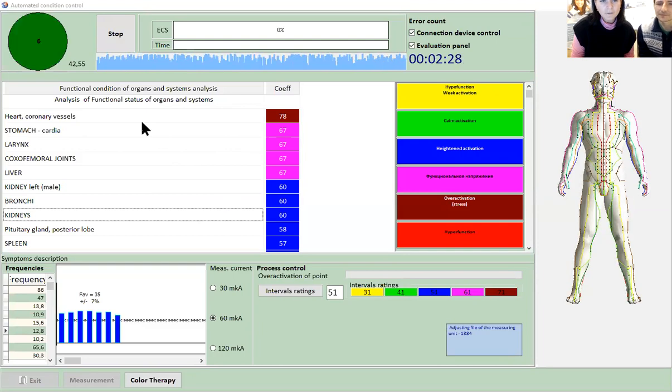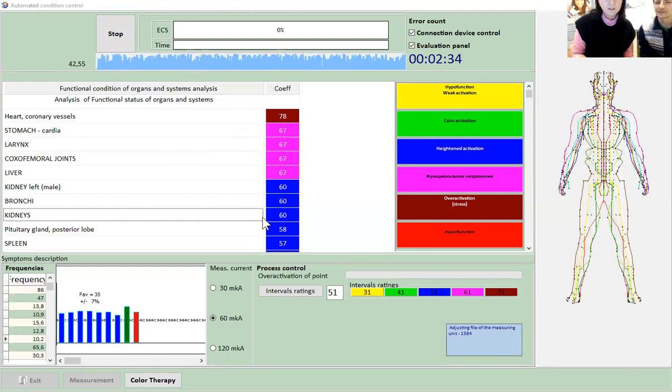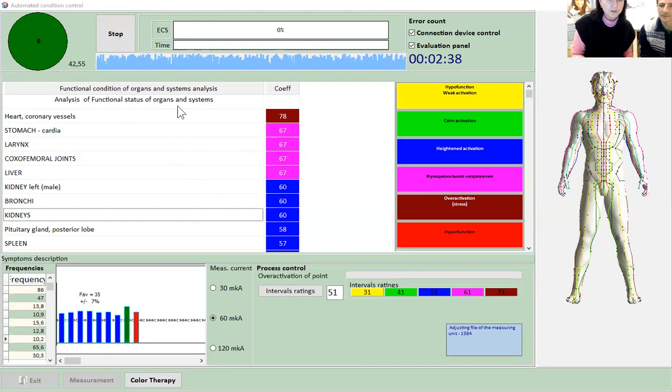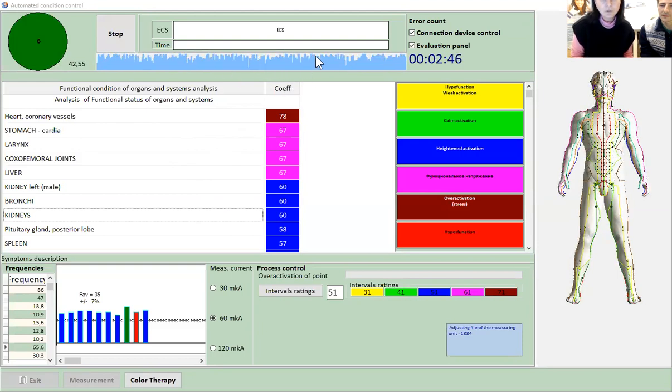So look, now it's his heart vessels. The program has done the first measurement, and now it's doing the treatment. You can see these frequencies up here, the blue ones, that are running through his body.